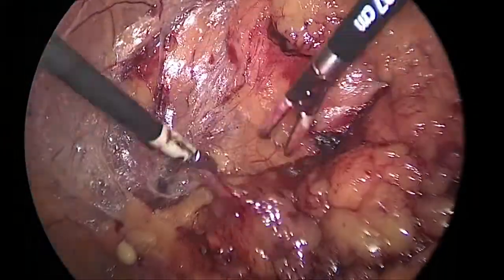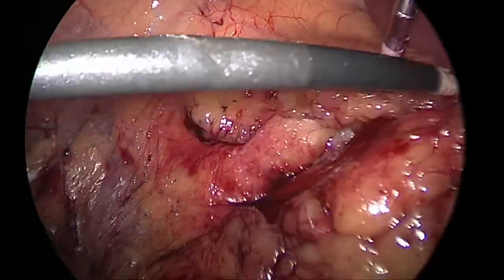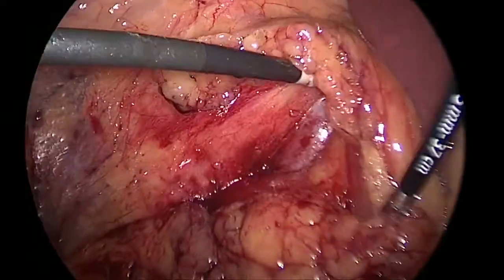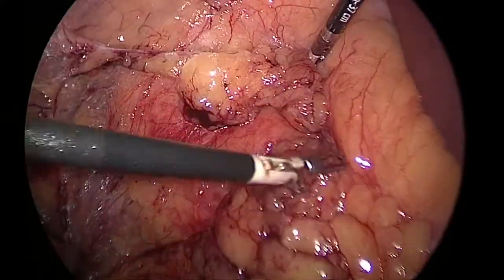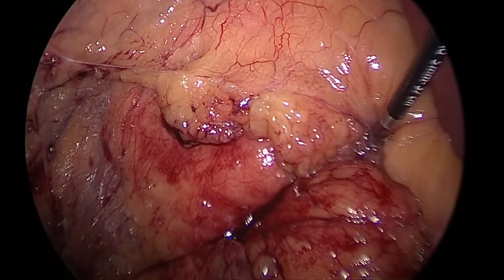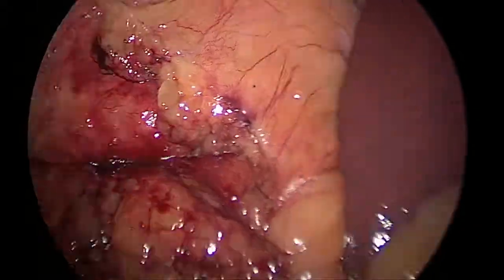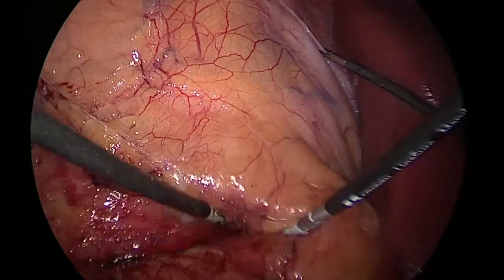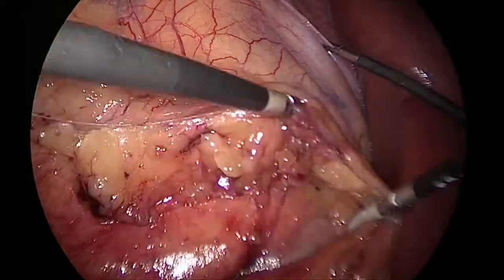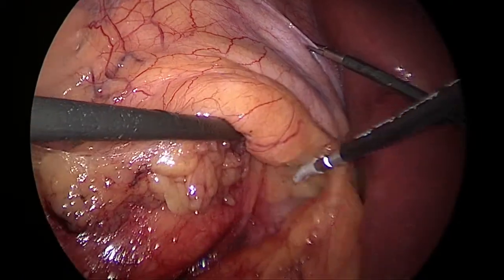In most cases where the patient is not that obese, the IVC can be seen even without mobilizing the duodenum. Here the belly is too bulky, we even cannot retract the liver properly. To retract the liver, we usually put a port in the epigastric region, but in this case we put the liver retracting port much more medially. Even then the forceps cannot reach up to the parietal wall. So we could not retract the liver properly.